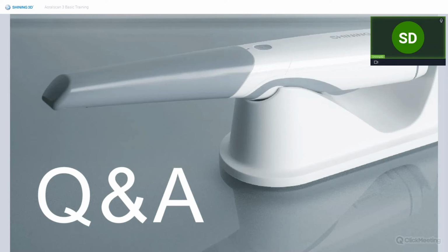In the presentation, you said the orthodontic teeth movement was just for reference, but if I want to make the whole process, can I trust it? I suggest not. If you are going to do a real orthodontic case, you need to use some professional designing software.